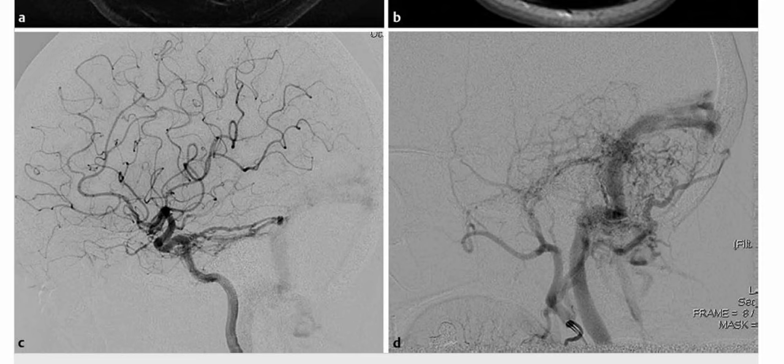Additional imaging revealed the primary arterial vascular supply from the meningohypophyseal trunk, the middle meningeal, ascending pharyngeal and occipital arteries. So this is a dural-based arteriovenous shunt, and the diagnosis here is of dural arteriovenous fistula.